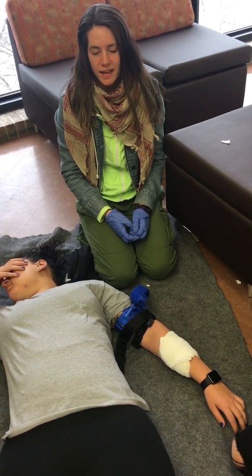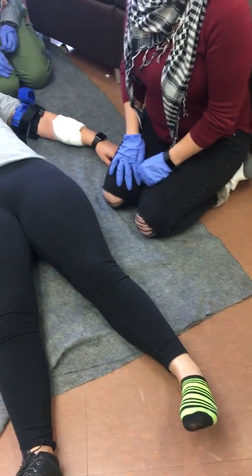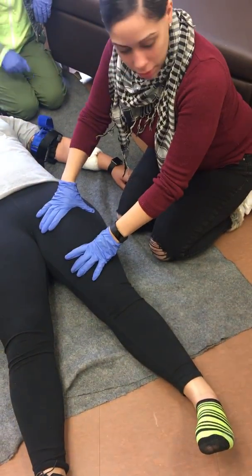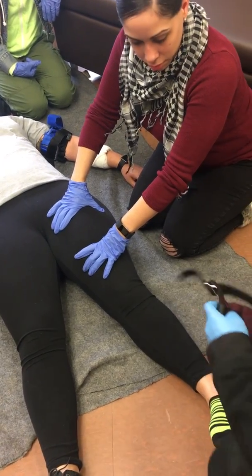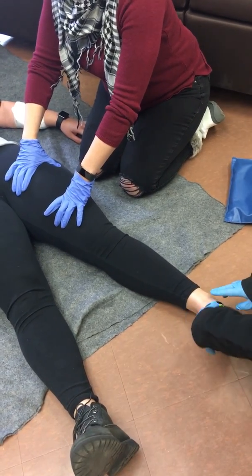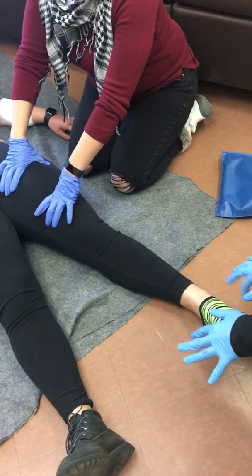Now we notice that she has a broken leg that she's crying and screaming about. Okay, holding stabilization on the femur fracture. Alright, manual stabilization, I have the ankle hitch applied. I'm gonna throw this on, but before we do that, I'm gonna check PMS here. Alright, we have a pulse. You can wiggle your toes. Which toe? The big one. Alrighty.